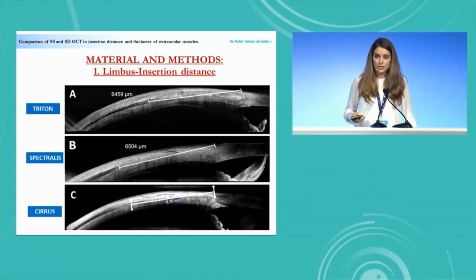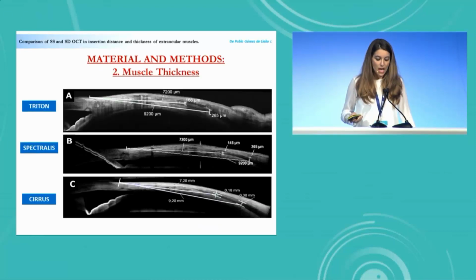Please direct your attention to the measurements of the limbus insertion distance of this lateral rectus of the same patient using the three devices. And now focus your attention on the measurements of the muscle thickness of this medial rectus.